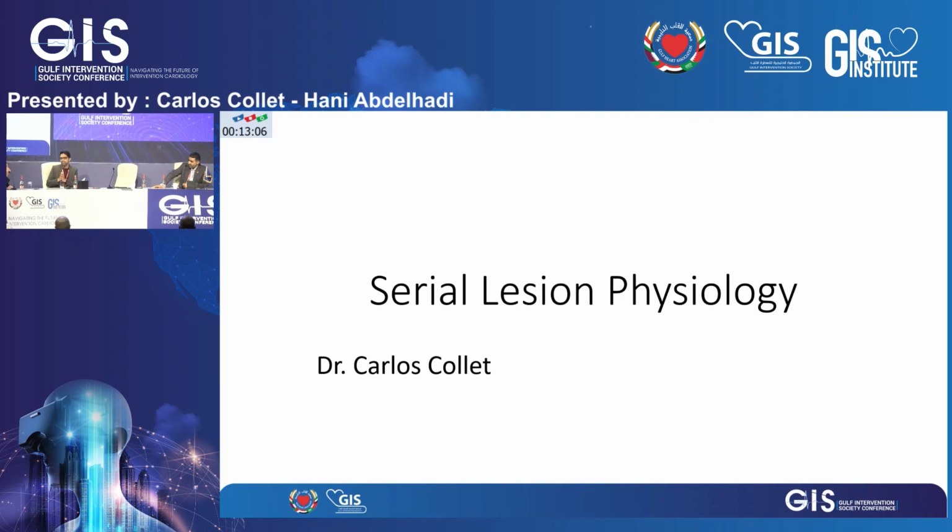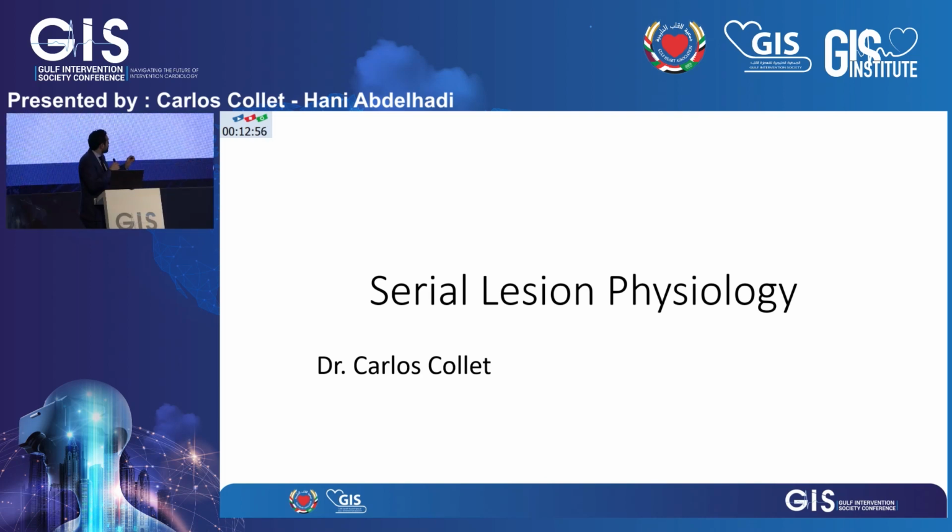One thing that FFR has inadvertently done, or iFR has inadvertently done, is it's made it vessel-based instead of myocardium-based. I don't want to delay the presentation, but we have published something that we call the global FFR, which is the sum of the 3 vessels. And you're completely right. The lower the number is, the worse you will do. The higher the number is, the better you will do. That's with the FAME data.